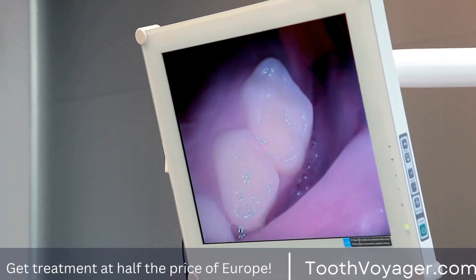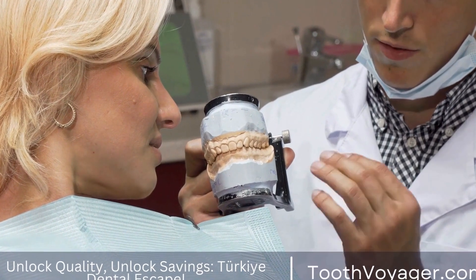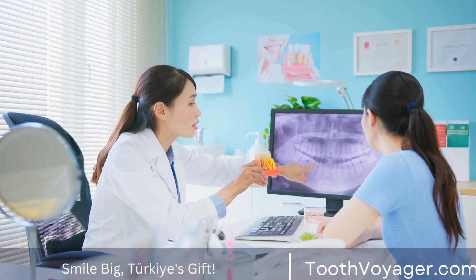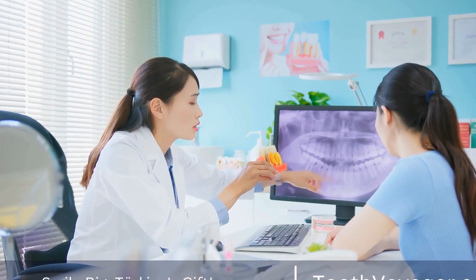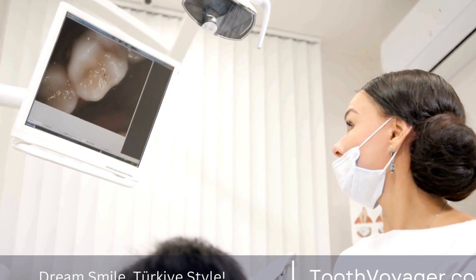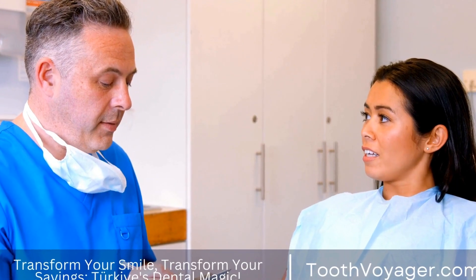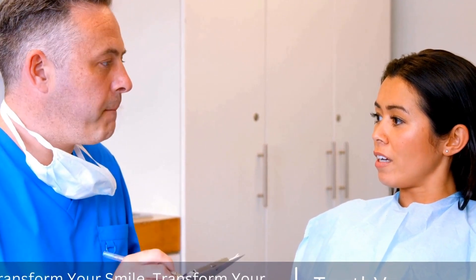How Are Dental Bridges Installed? The installation of dental bridges typically requires two visits to the dentist. During the first visit, the dentist will prepare the abutment teeth, which are the teeth on either side of the gap where the bridge will be placed. This involves reshaping these teeth to make room for the crowns that will hold the bridge in place. The dentist will then take impressions of your teeth, which will be used to create a custom-made bridge that fits your mouth perfectly.